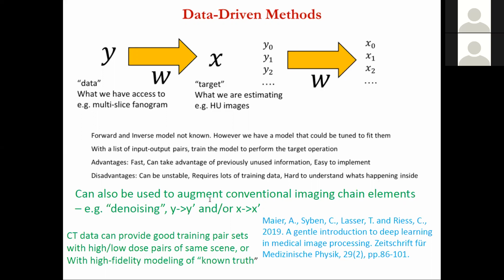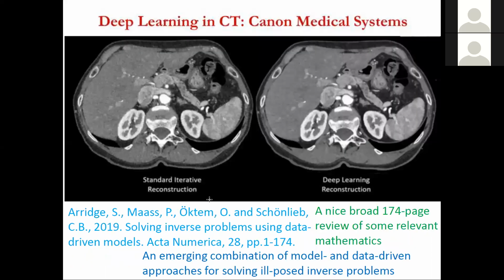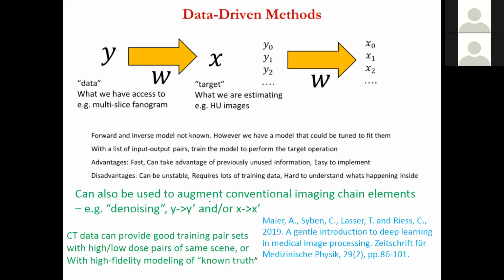At the moment, that's not what people are doing yet, if they're ever going to do that. What they're doing right now is operating, I skipped a slide, in projection space or in image space. Projection space to projection space or image space to image space. Then you're fine. Then you're using a lot of the things that have been developed for the image, the original functions that these data-driven methods were developed for.